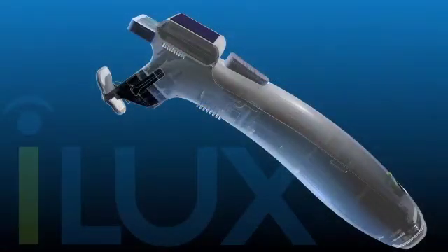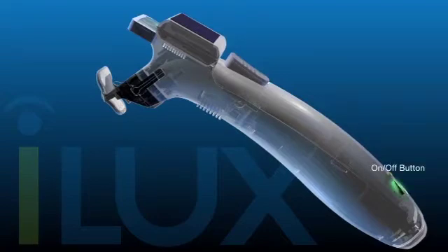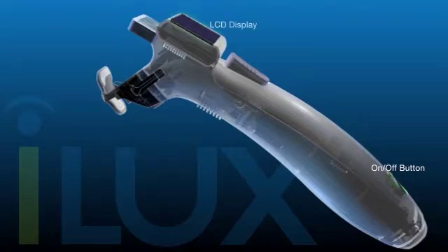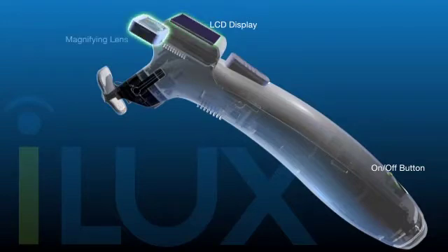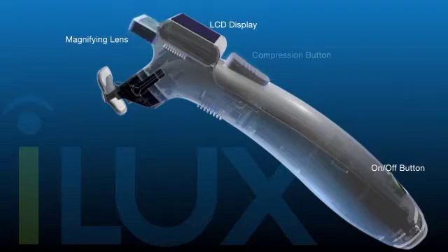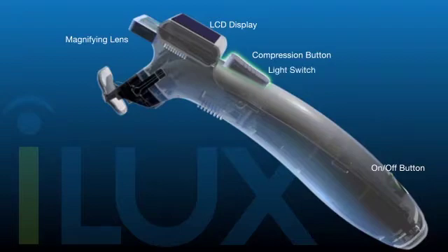The EyeLux device enables quick evaluation and then treatment of dysfunctional glands. The on-off button powers up the device and starts a series of self-tests. The LCD displays data and status messaging during the procedure. A magnifying lens provides a close-up view of the eyelid margin. The compression button squeezes the eyelid. A slide switch on the compression button turns on a light-based heat source to warm the eyelid. The EyeLux is powered by rechargeable batteries.